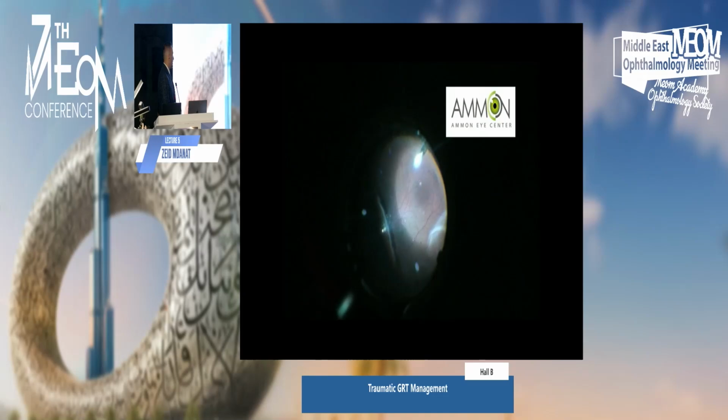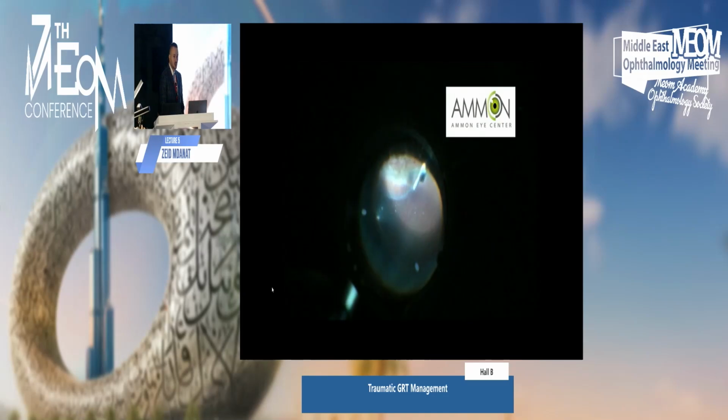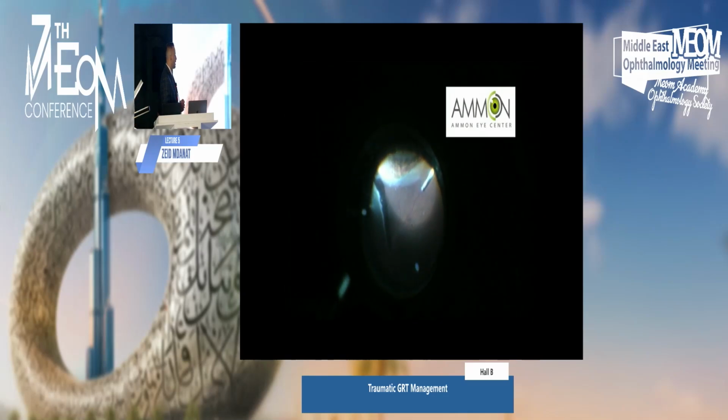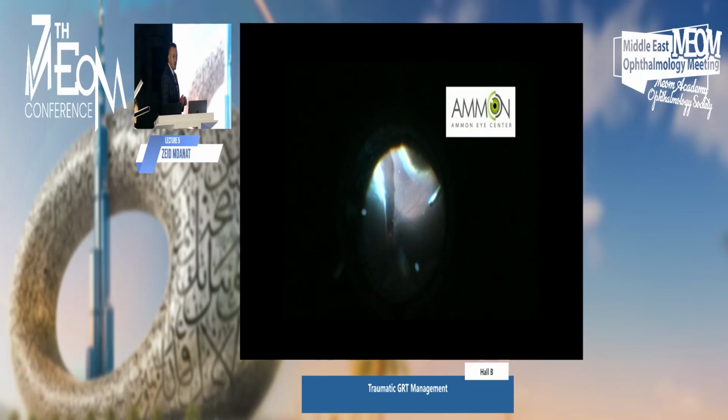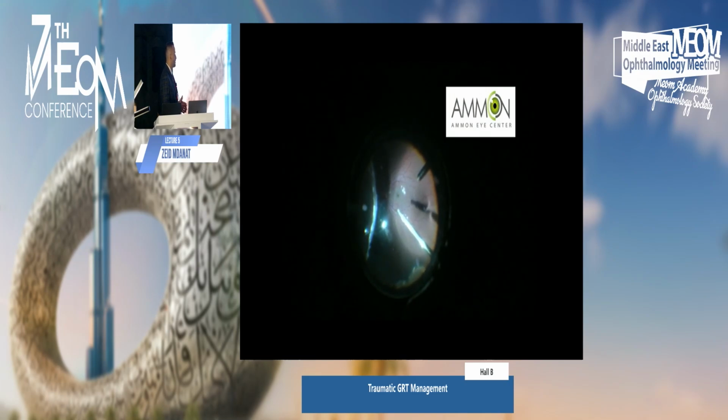Now, going back into the retina, doing a meticulous search, first of all, to locate the extent of the GRT and to also locate the horns of the GRT. I think the horns of the GRT should be treated very well too, because there is a tendency sometimes for the tear to extend later on beyond that area. So again, the vitreous is removed carefully and the search is completed.